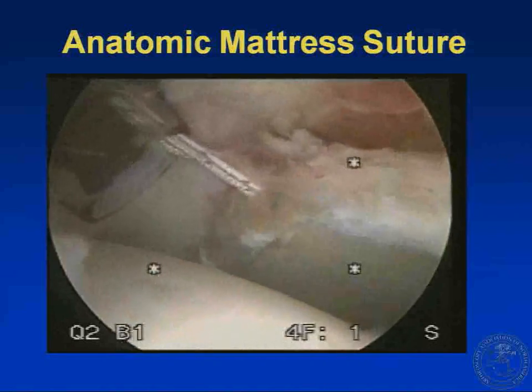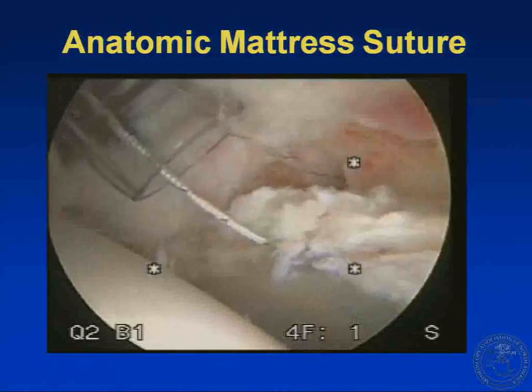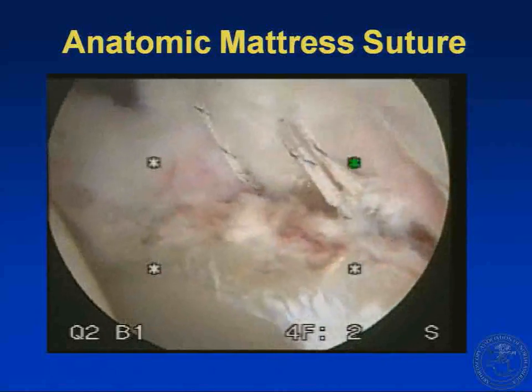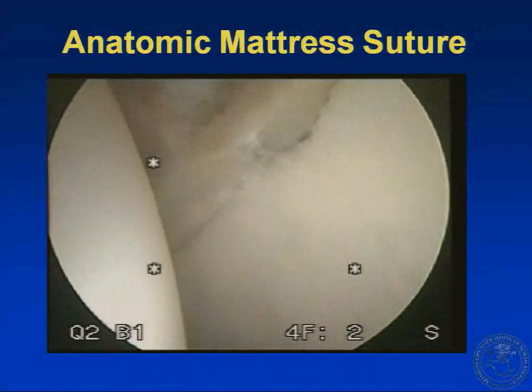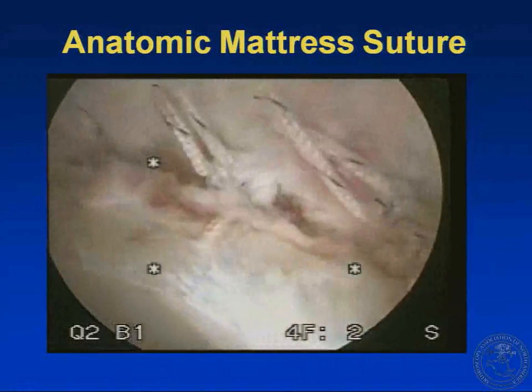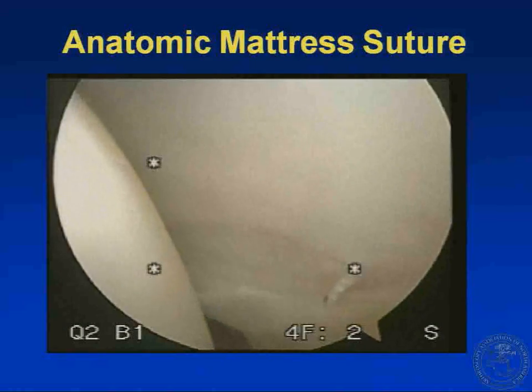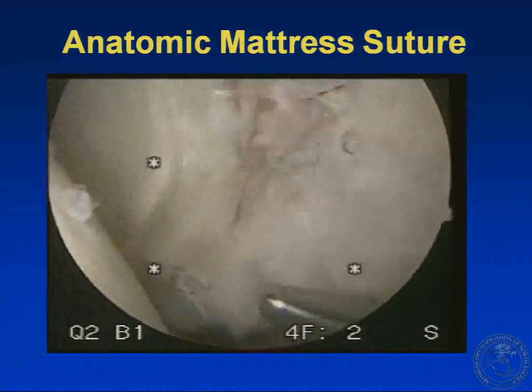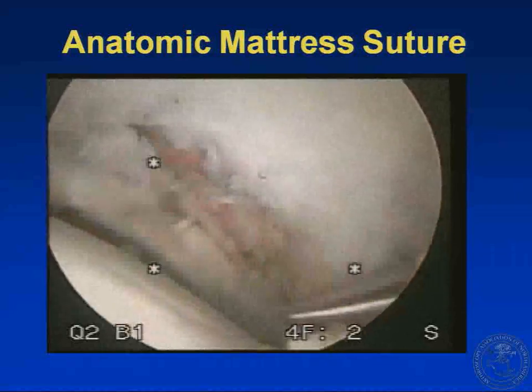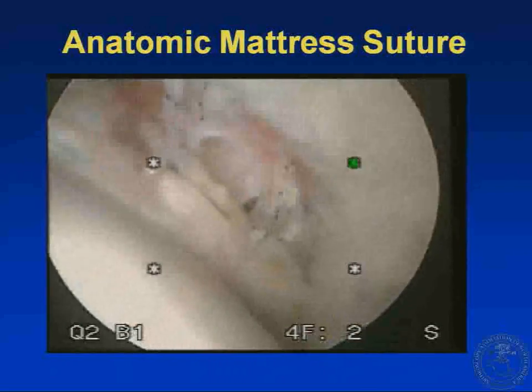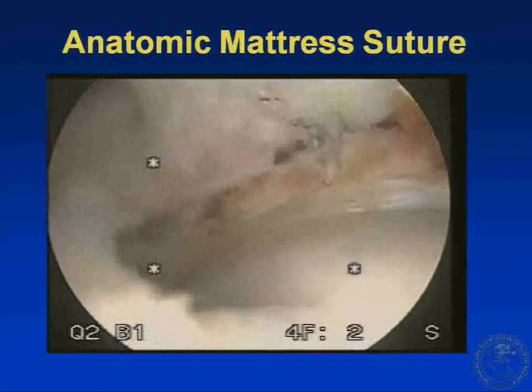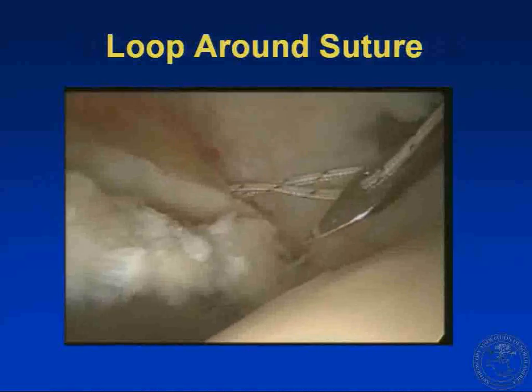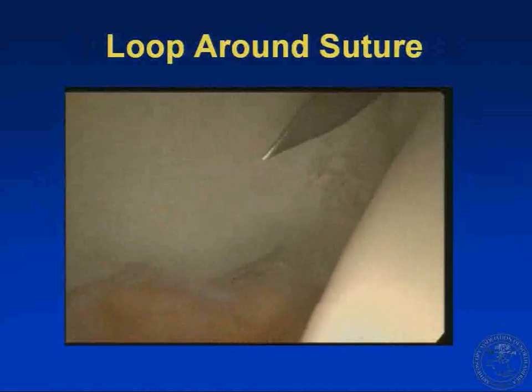The suture is then brought back and standard knot-tying is performed. In this case five suture anchors were used. You can see that the triangular free edge of the labrum remains free to maintain a seal all the way around. Traction is then released to verify whether the seal is being recreated — and in this case the seal is maintained from anterior to more superior.